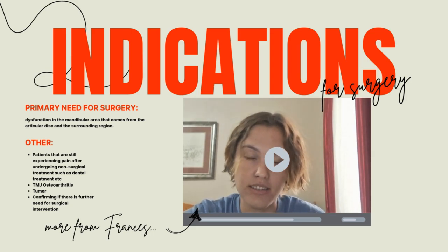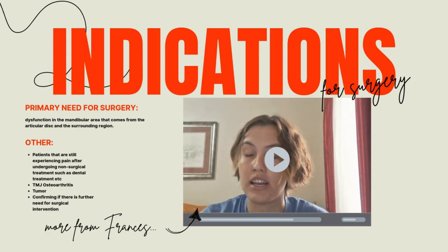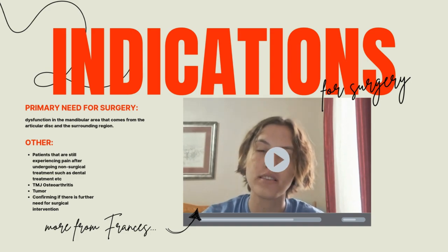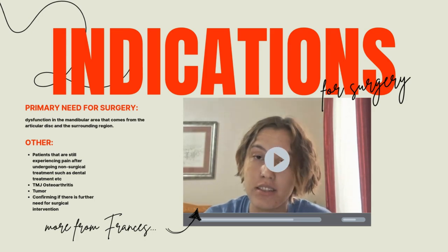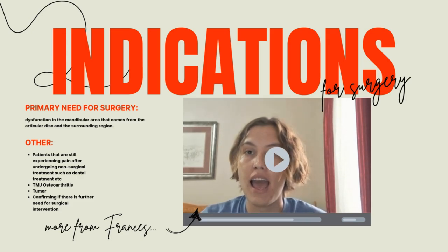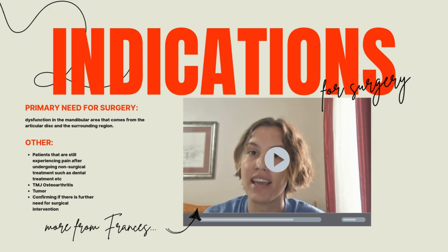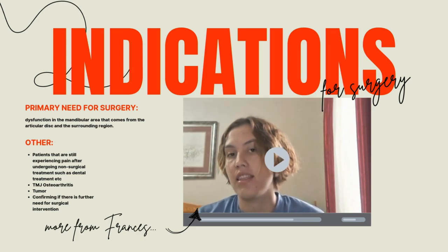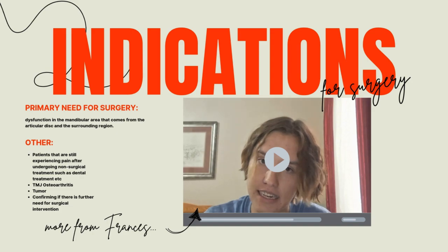There are other indications as well, other than these main indications. Other indications include patients that still have constant jaw pain even after non-surgical intervention, so they went to see a dentist, they went to see a chiropractor to work on the joint. Another indication is osteoarthritis, tumors, and since arthroscopy is not a very invasive procedure, the surgery also helps to confirm if further surgical intervention is needed.